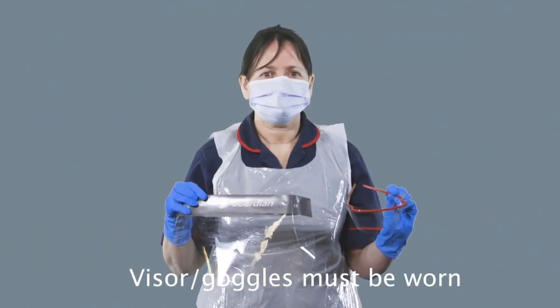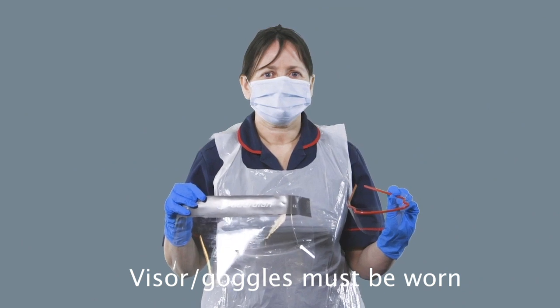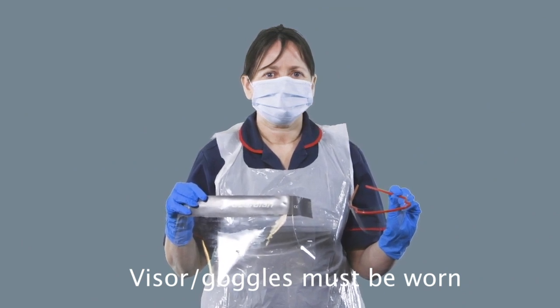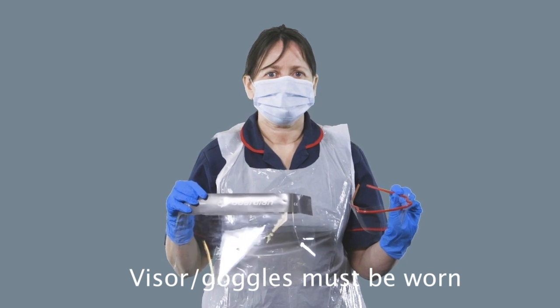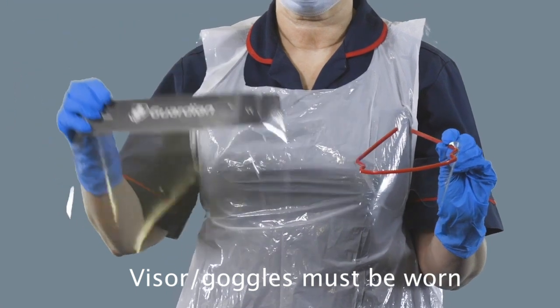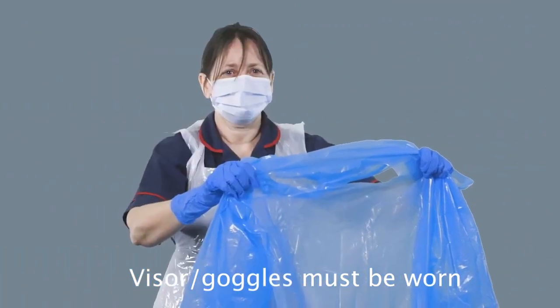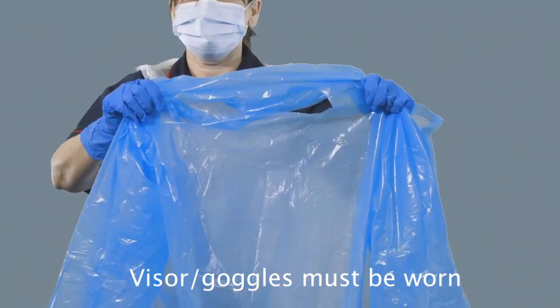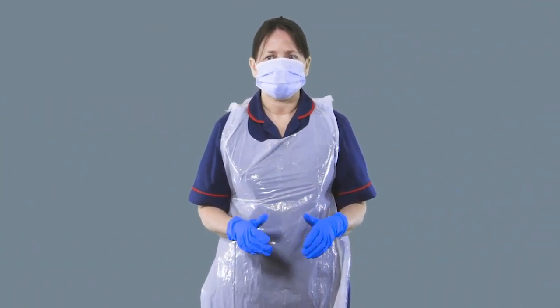As with all situations, you have to do a risk assessment. If you deem there is a high risk because you have a patient who is coughing a lot and may cough up sputum, you may need to add in a face visor or protective goggles. Alongside this, you may also add in a long-sleeved apron. You are now ready to take your swab.